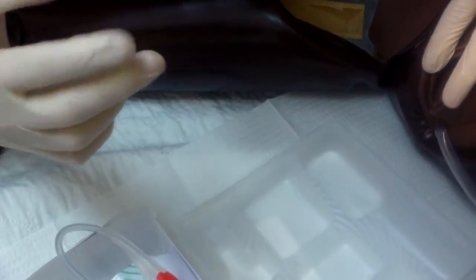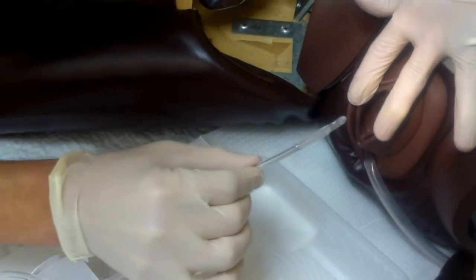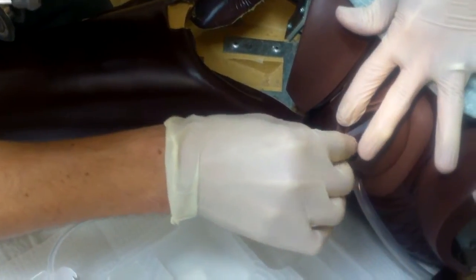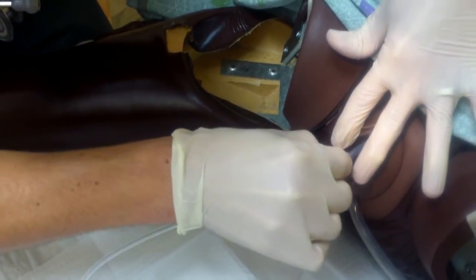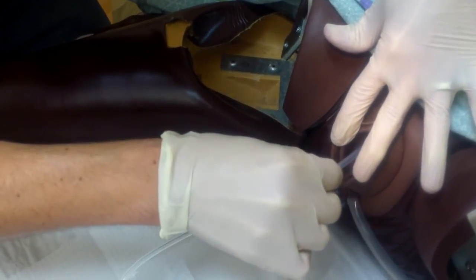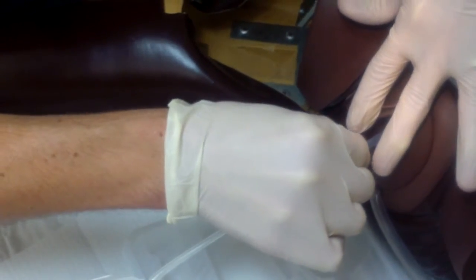Now this is where I really need to be considerate, and my helpful assistant with a pen light. I'm going to take the first little part, and I'm going to insert it without touching anything else right into the meatus. I'm going to insert it about 2 inches, because that is probably about the urethra. And then once I do, I should get some urine, which I have, and then I'm going to insert it about another inch or 2 to make sure that it is well inside the bladder.